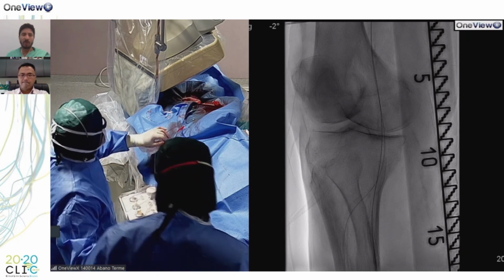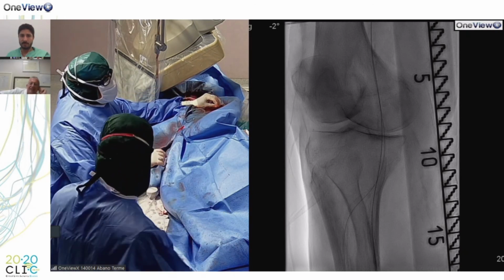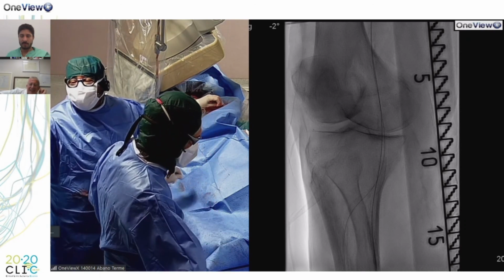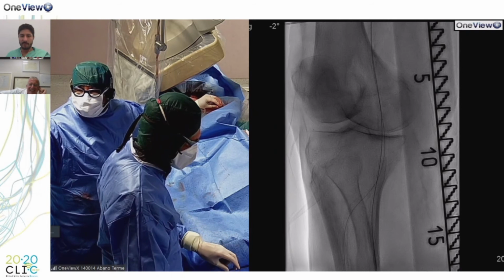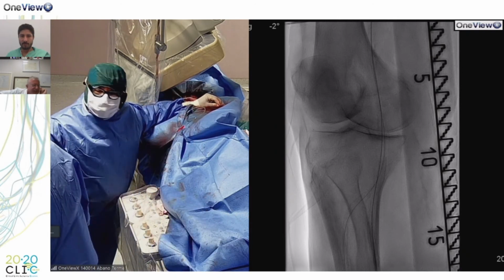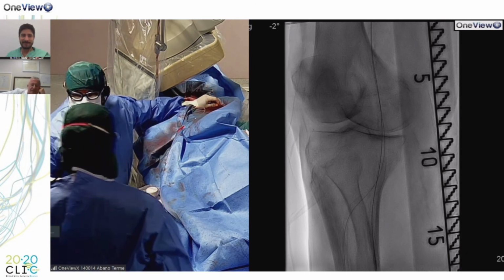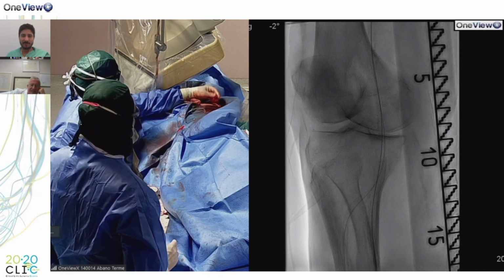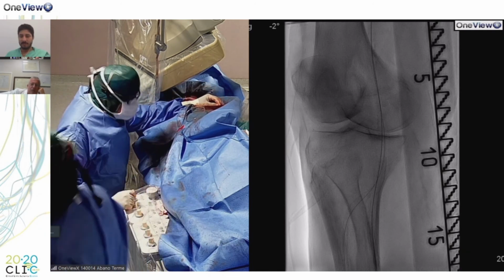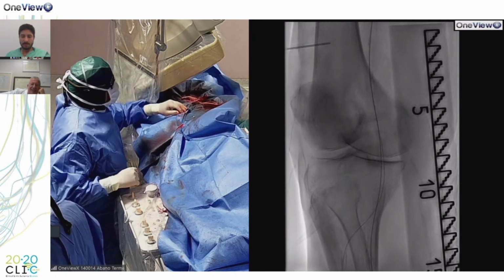Allora, mi dai un'Eluvia 6? Talking about 6 millimeters. For the Eluvia stent, mi dai un 6 mm, il più corto che hai? 70, 6,70, e un Dorado o un Mustang di analoga misura. But Marco, choose the right size.